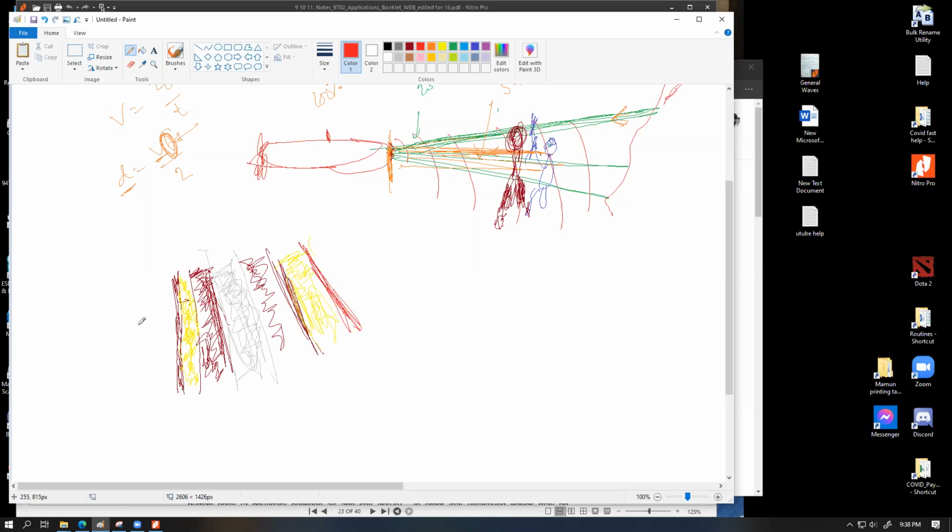And on the left of the skin, we have air. On the right of the skin, we have air. So this is a very basic representation of how a human body can be standardly considered: skin, fat, muscle, bone, muscle, fat, skin. A very basic idea. Now, every single time, let's say we are about to make an ultrasound scan of this part of the body, we're going to place the probe over here.